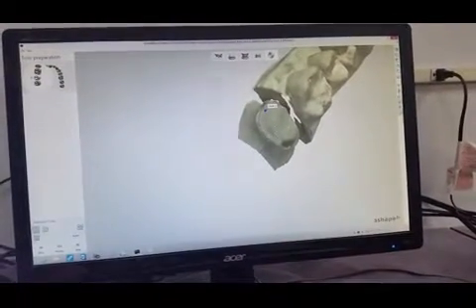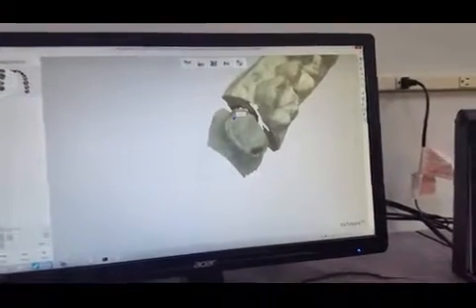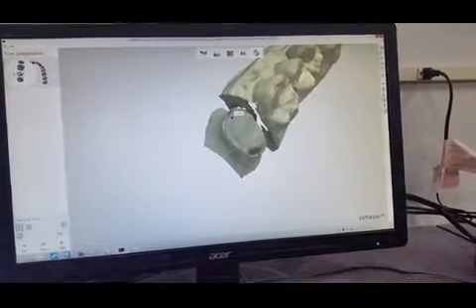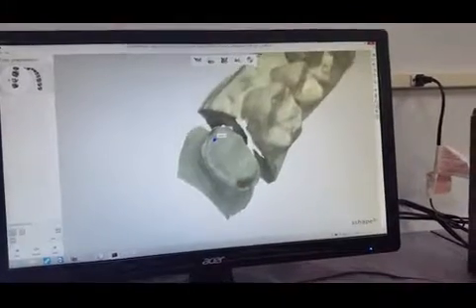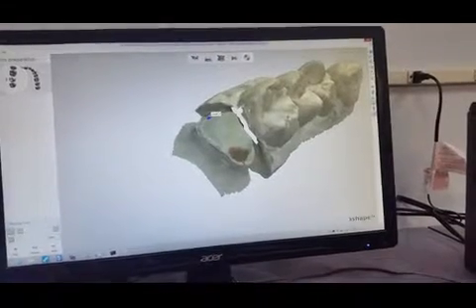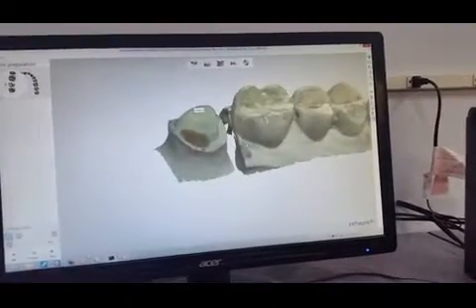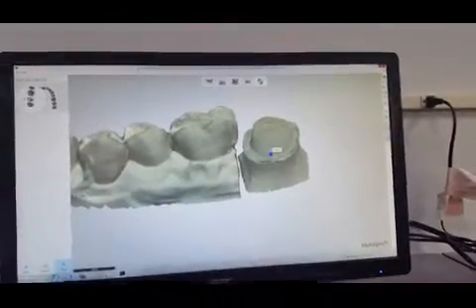I got this little hole right here on the scan. Now I could take it one more step and scan the model again to close the hole without the die in place, so it can get a better image on this area. Nevertheless, that's probably unnecessary because my contact is right here and I got all the information I need to work with. So even if I do another scan and pick up this, it's not going to help me or hurt me. So I'm just going to let it go, and we're going to tell it to go ahead and proceed.